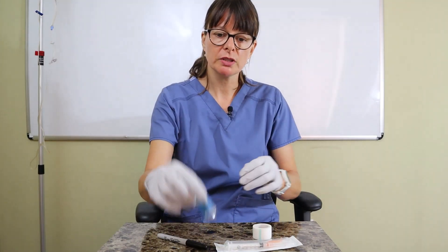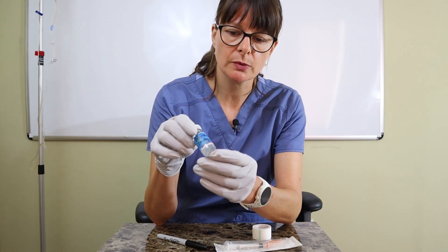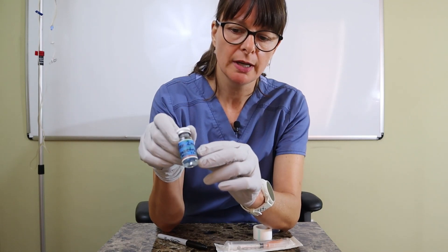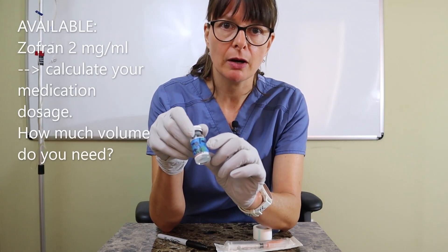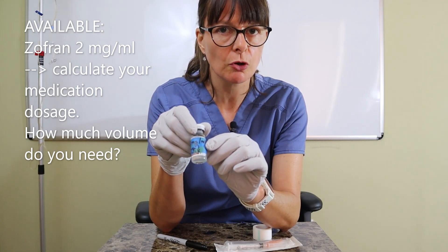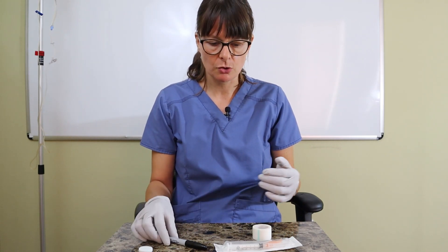This is a multi-dose vial, and make sure that you check and see what it says. In this case, it's labeled as Zofran or Ondansetron, 2 milligrams per ml. Because I need to administer 4 milligrams, I need to draw up 2 mls. Always know how much volume you need, and then pick an appropriate size syringe.